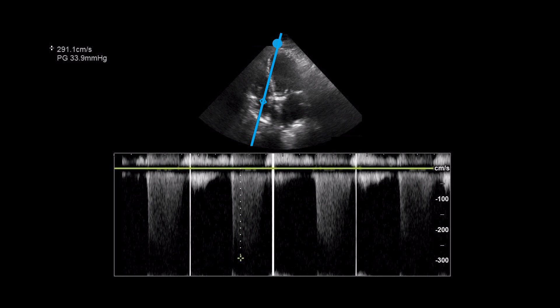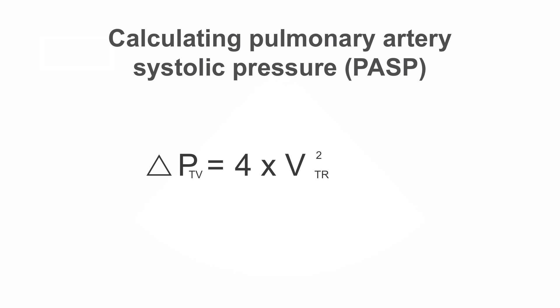We can then measure the velocity of the peak jet using the controls on the ultrasound machine. In this image, you can see the calipers are designating the peak velocity, which is then depicted at the top left of the image. The value in this case is 291 centimeters per second. We can then use this to calculate the pulmonary artery systolic pressure.